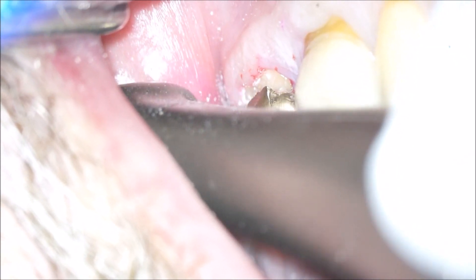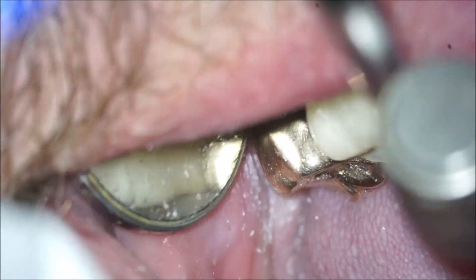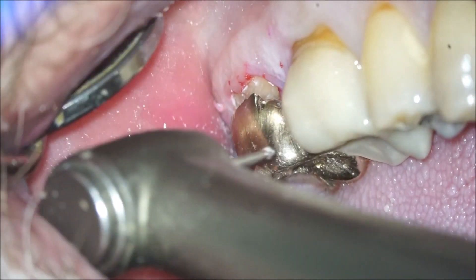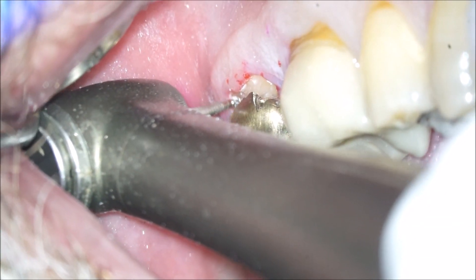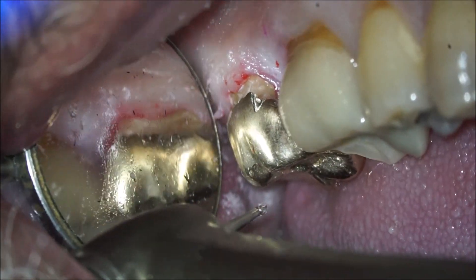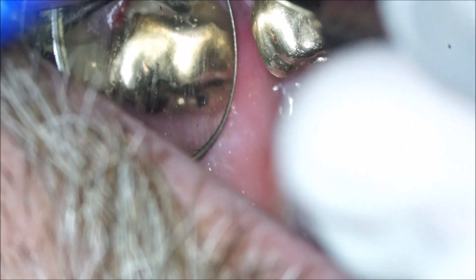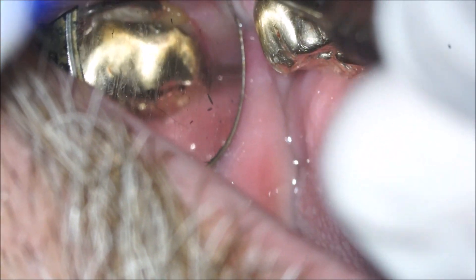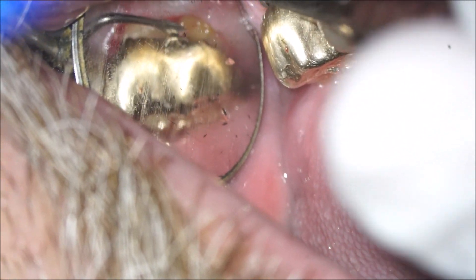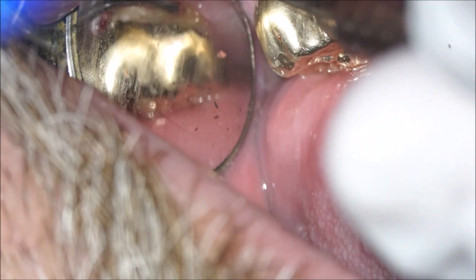It may be difficult to tell, but when I'm doing this I'm also creating a little bit of retention in the tooth. It is amalgam — it does have to be mechanically retained. There's the slightest bit of an undercut with the edge of the tooth and up underneath the crown, and that's going to mechanically retain this. Then finally, coming back to get the very last bit of decay in the deepest portion with an excavating spoon.